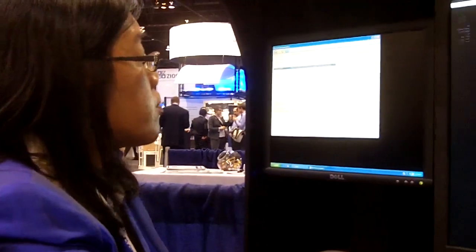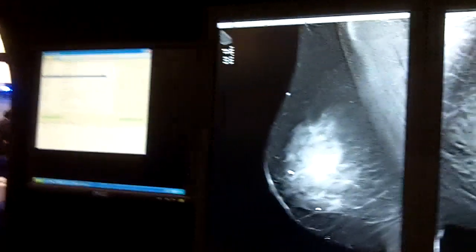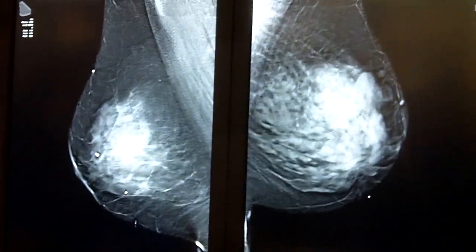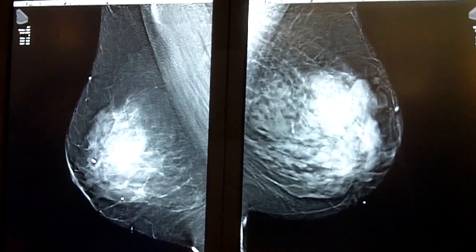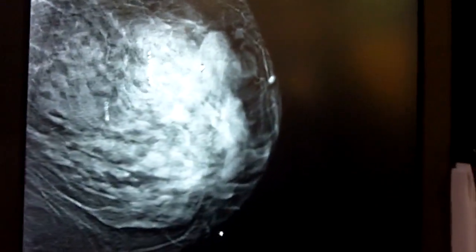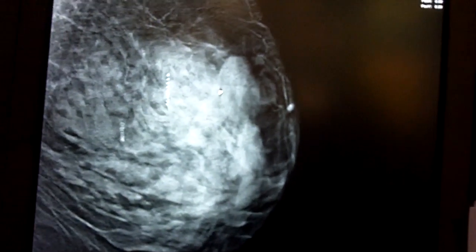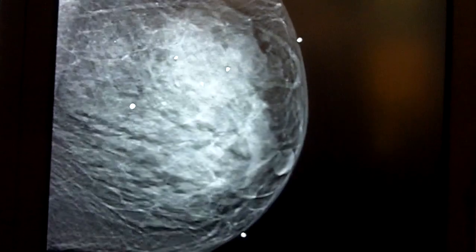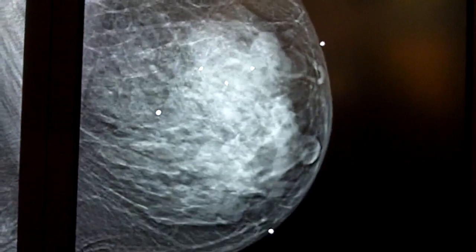It also provides the ability to filter out artifacts that are not in the plane of focus. In this particular case, these are streak artifacts that come from the projections — these are the projections. When you go to the 3D view, you see them. We are able to filter those out to allow the radiologist to see things that are not in the plane of focus and really make a good diagnosis.